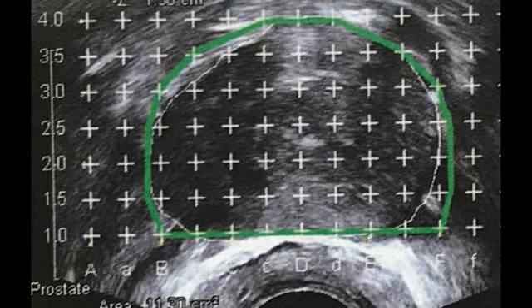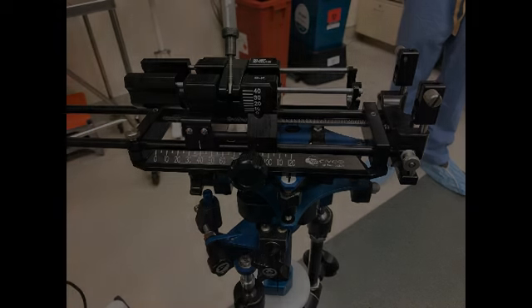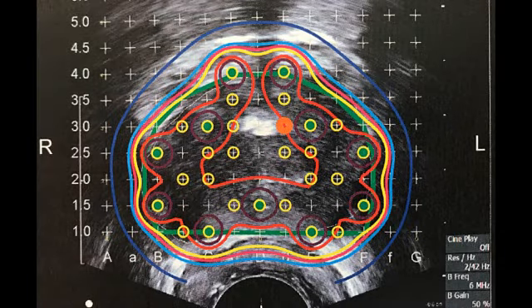Let me just start by showing an image. This is a prostate scan for an implant, and the probe is actually down here in the rectum. It's the circle at the bottom, and then you're visualizing the prostate. It's outlined here in green. And the grid is for inserting seeds. Seeds are actually inserted with this stepper mechanism to index exactly how far in you want. And the probe sits in this holder, and then the seeds are put in, and here's a picture of where the seeds go in the end and the dose distribution.